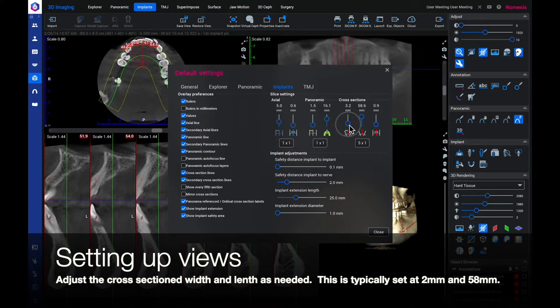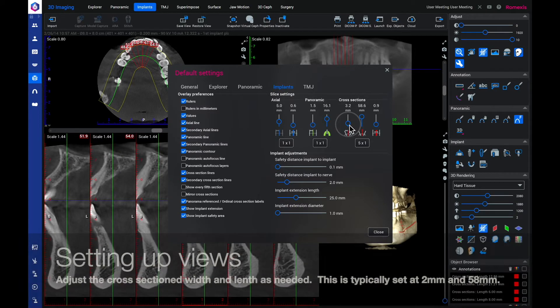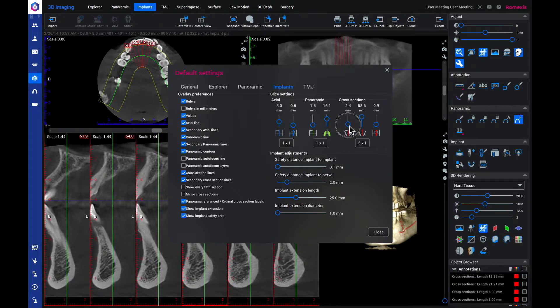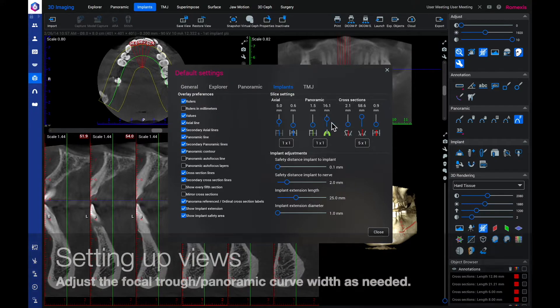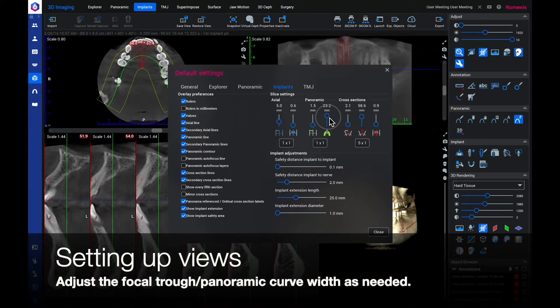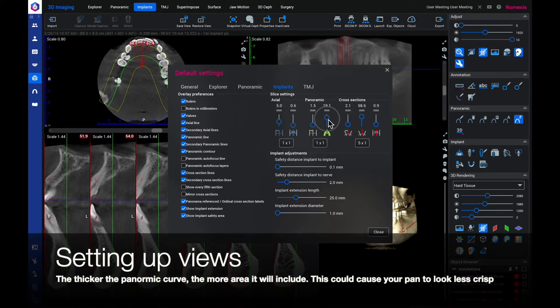The width is typically set up at 2 mm and the length is typically set up around 58 mm. Adjust the focal trough and panoramic curve width as needed. The thicker the panoramic curve, the more area it will include. However, this could cause your pan to look blurry, so adjust to the patient's anatomy as needed.